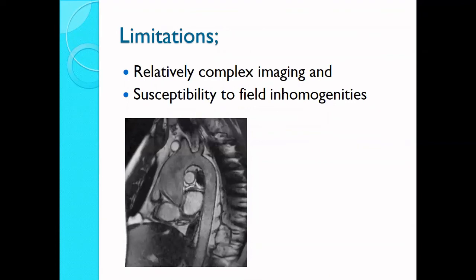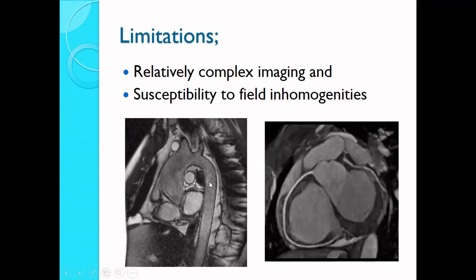This particular image is a sagittal image of cardiac imaging, cardiac angiography. So you can see the left ventricle in great detail. The left ventricle is here, and then there is the ascending aorta, the arch of the aorta, and the descending aorta. Then the thoracic aorta and the abdominal aorta. So you can see a good differentiation between these. Then you can see the other branches that go upward, which are the brachiocephalic, the common carotid, and the third branch is there.